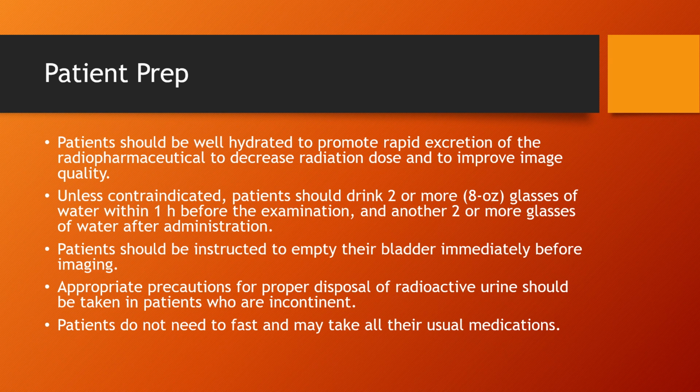The patient should be well hydrated to promote rapid excretion of the radiopharmaceutical. This decreases the radiation dose, but it also improves the image quality. Unless contraindicated, that means drinking 2 or more 8-ounce glasses of water within 1 hour before the exam, and another 2 or more glasses after administration of the radiopharmaceutical. So we want to encourage them to drink a lot of water. Patients do not need to be NPO for this study, but a lot of times they think they do, which means they didn't drink any water. It's okay to go ahead and give them something to drink before they get started.